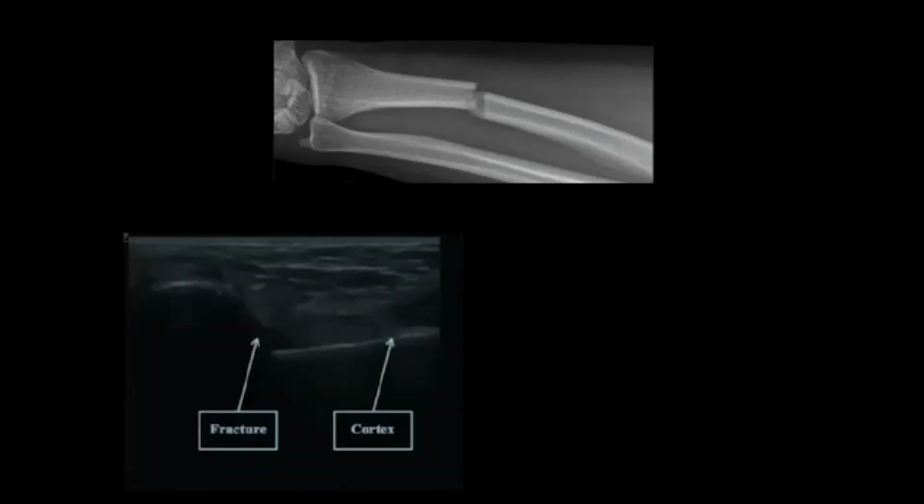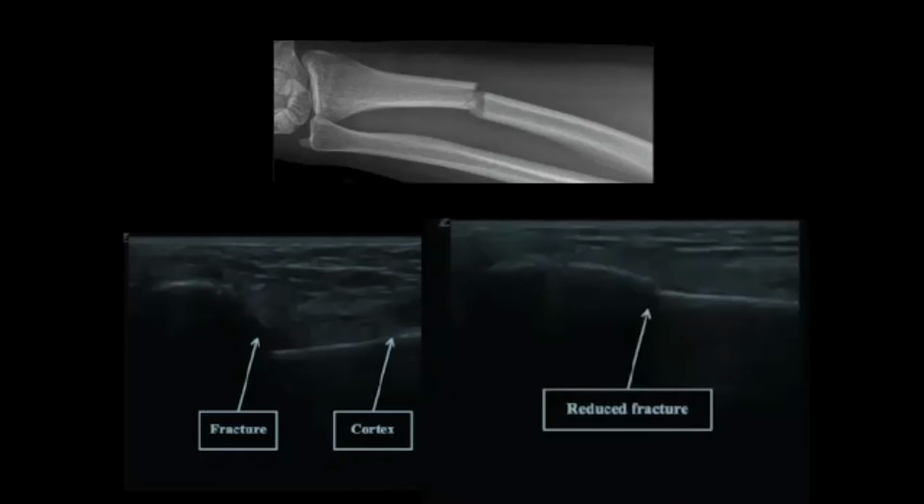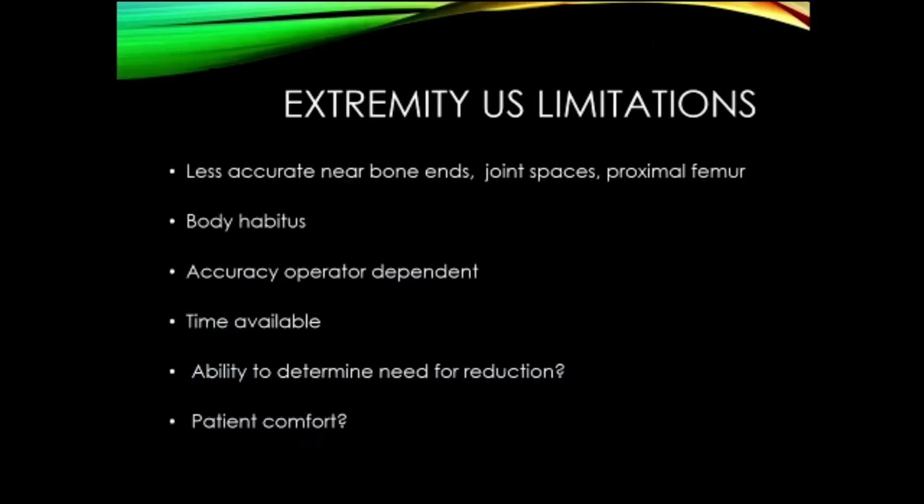So here you can see the fracture, the cortices, and then you have the reduced fracture. Oops, I went kind of through that pretty quickly, but that's demonstrating that the fracture has been reduced. You know, and if you're somewhere in an ED where you don't have a C-arm, this would actually be a great use for ultrasound.